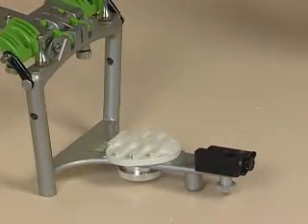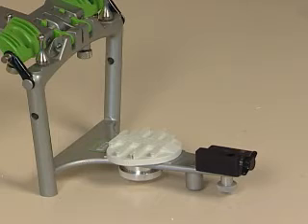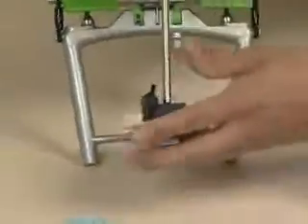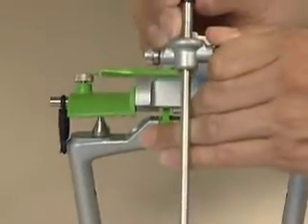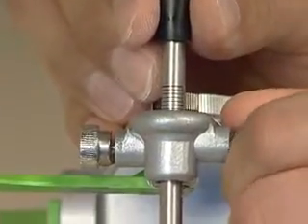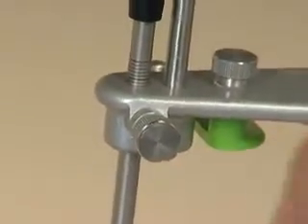And the next thing, we're going to get ready to mount our lower model. The first thing we're going to do is set our incisal guide pin at +3. That means that we're going to put the red mark on the incisal guide pin flush with the top of the articulator. We've now opened the vertical dimension in the anterior segment 3 millimeters. So we've made the top of the articulator slightly up like this in relationship to the lower.